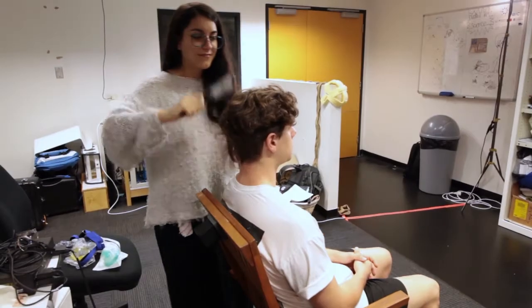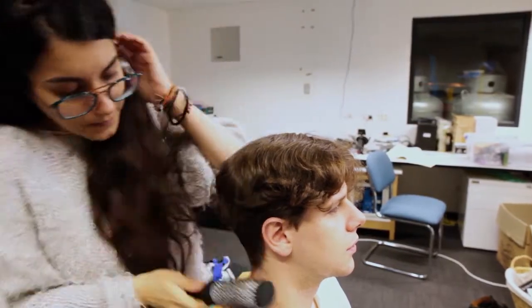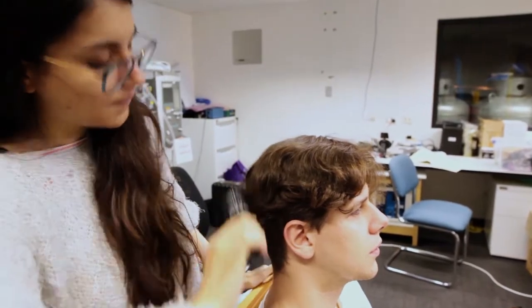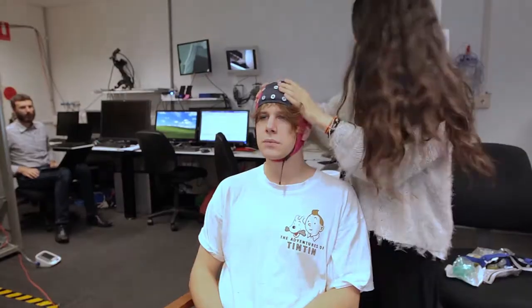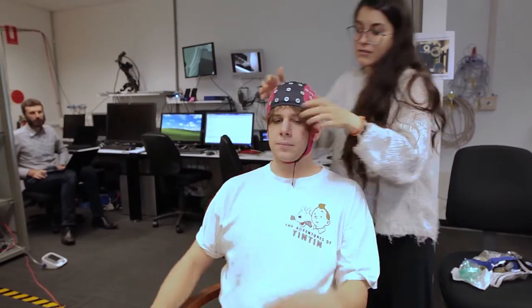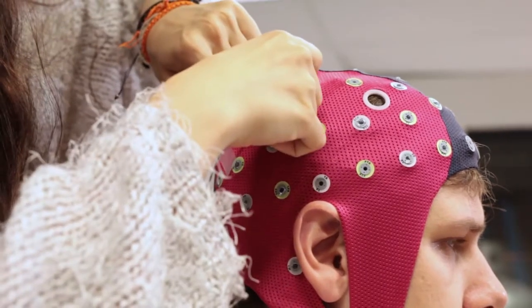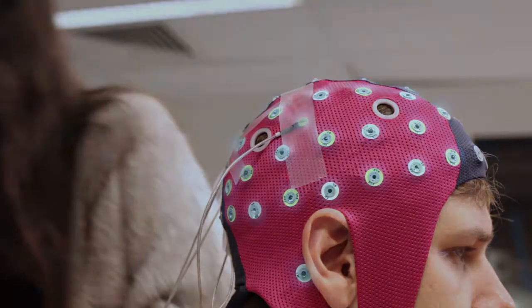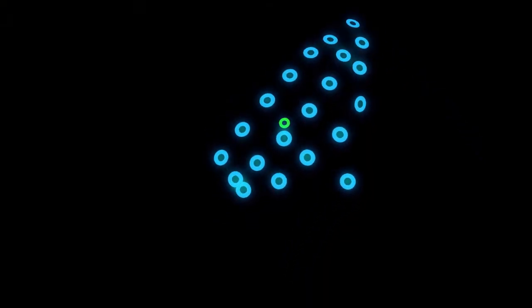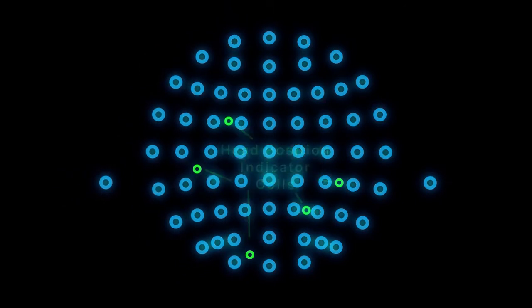To ensure high-quality EEG recordings, it is recommended that the subject's hair has been recently washed without conditioner and that their scalp has been firmly brushed to remove any dried or dead skin. An MEG-compatible high-density EEG cap is applied with the appropriate use of conductive gel. Head position indicator coils are then firmly attached at predefined locations on the EEG cap. All auxiliary biopotential electrodes are then applied at the designated locations on the subject's face and body.